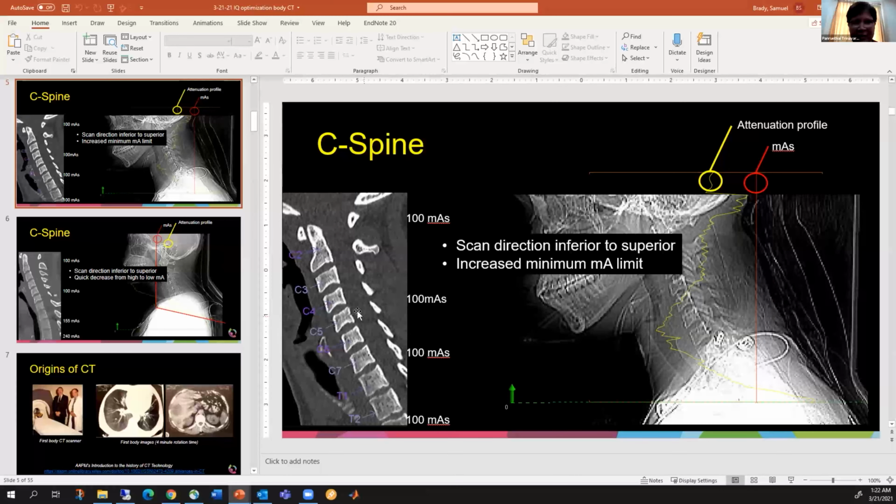I would like to ask more because there are some requests, like neck and chest, and if we like to do it in continuous, and probably with the hands up. That is a trick. If your arms are up and you're trying to image the neck, you're going to have a lot of artifacts. Neck and chest in continuous? Should we not do that? Should they split the examination?